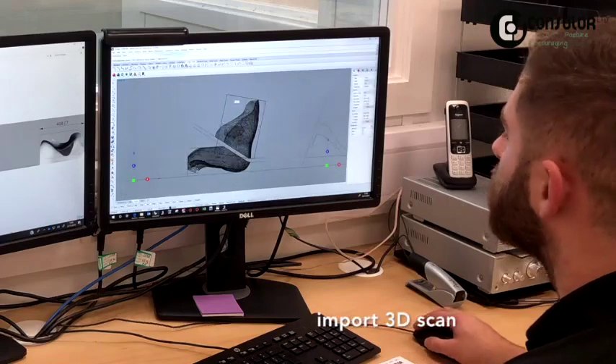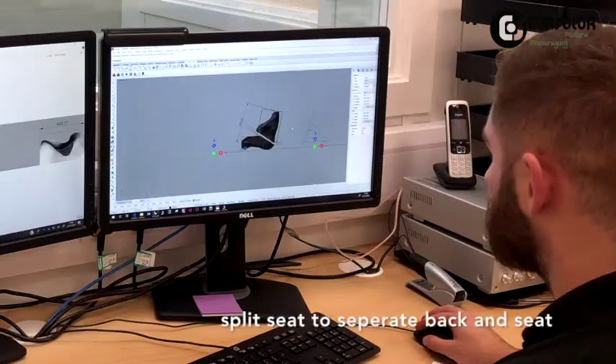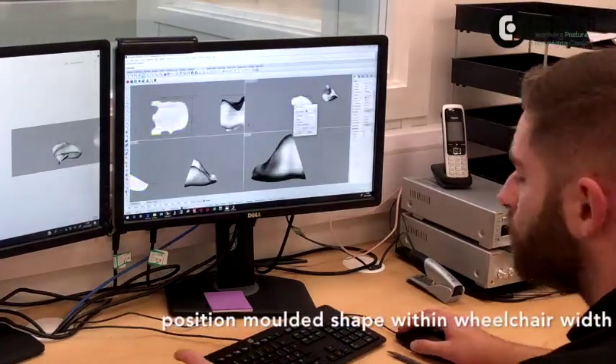We take the scan that was created in clinic from the client's postural assessment and moulding and finish designing the seat. We split the backrest from the seat cushion and program and carve them separately.